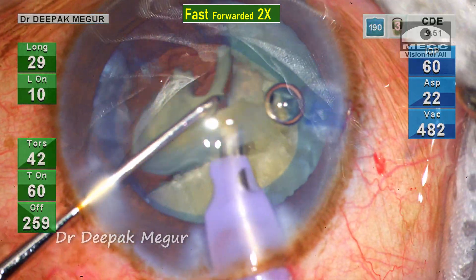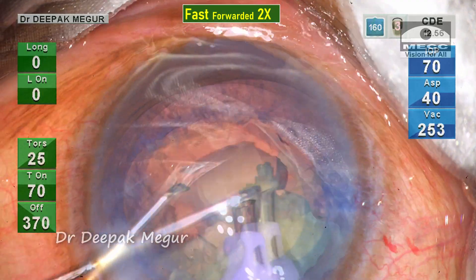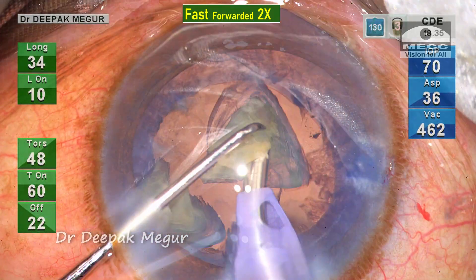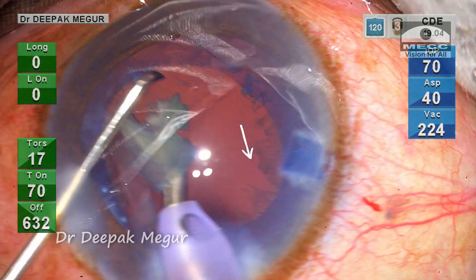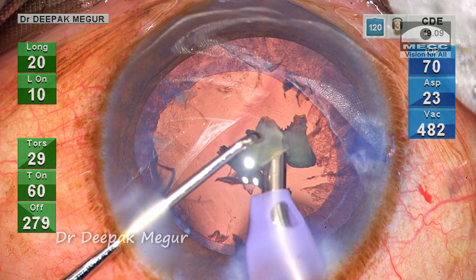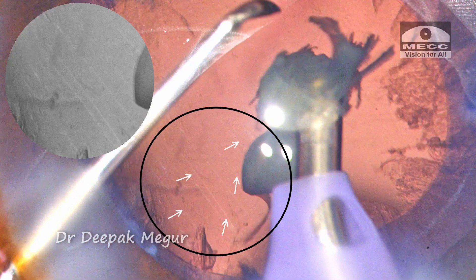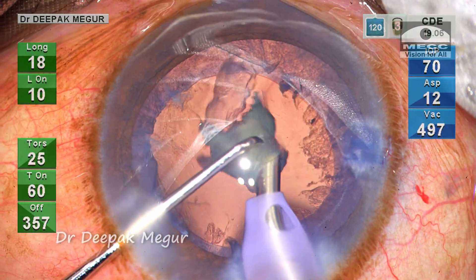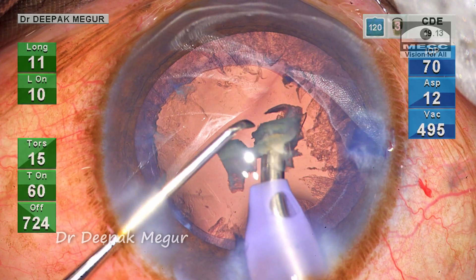As I begin emulsifying and aspirating these fragments, I feel that the posterior capsule is coming forward — it's bulging towards the phaco tip. I can see shimmering reflexes of the posterior capsule in the background, and as a result I am forced to work more anteriorly, very near to the cornea.